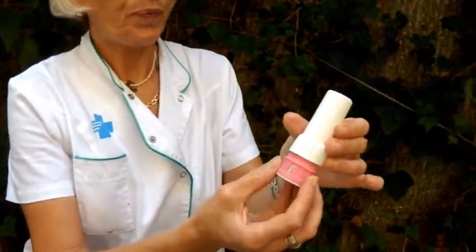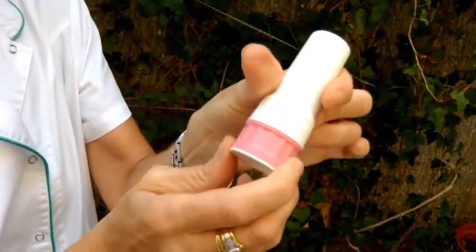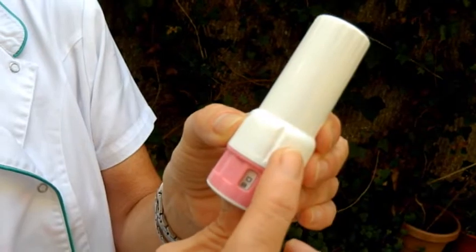Put the cap back until you hear a click. When finished, rinse your mouth and spit out the water. The Twisthaler is a multi-dose dry powder inhaler system. It is necessary to protect it from dampness.